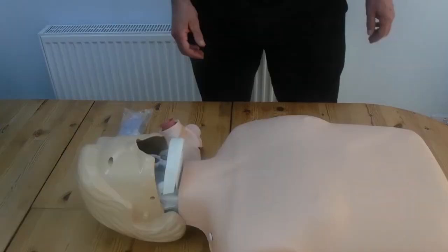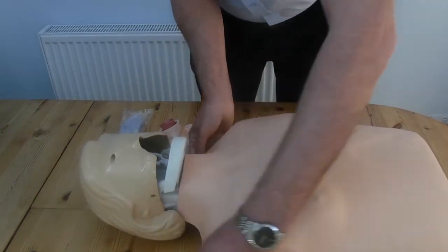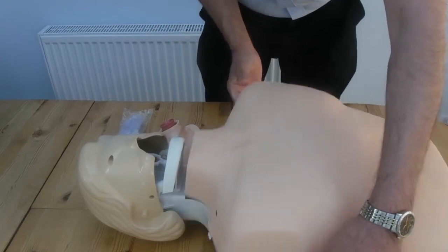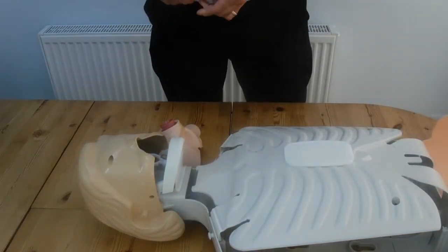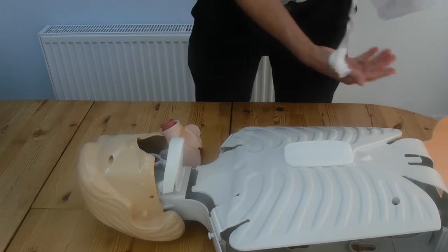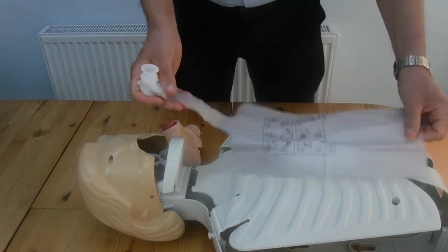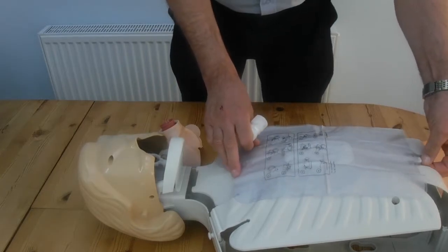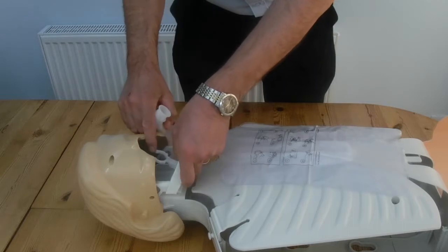Having cleaned our mannequin, I'm now going to insert clean lungs. Simply unhook the skin from the shoulders and the sides, peel it back, get the new lungs, tear open the packaging, and lay it out on the chest. There's a little lug that can go at the bottom — thread that through the lug there, and it keeps the lungs nice and secure during resuscitation practice.